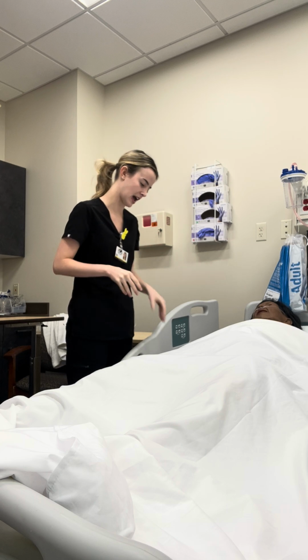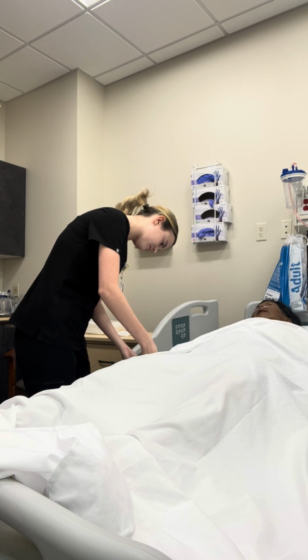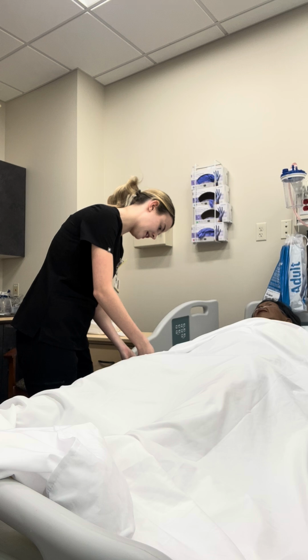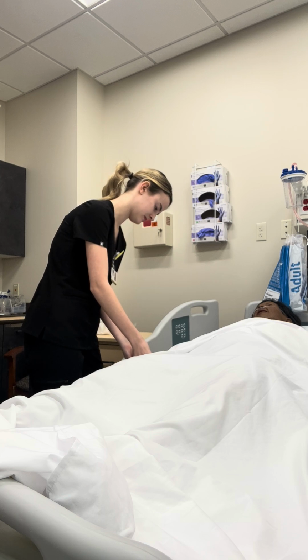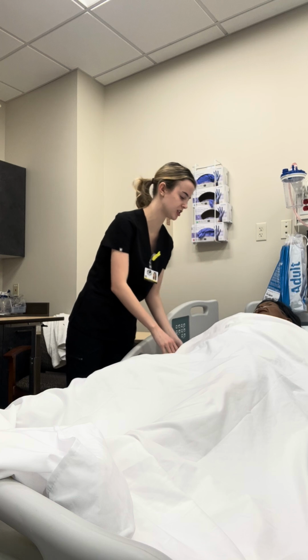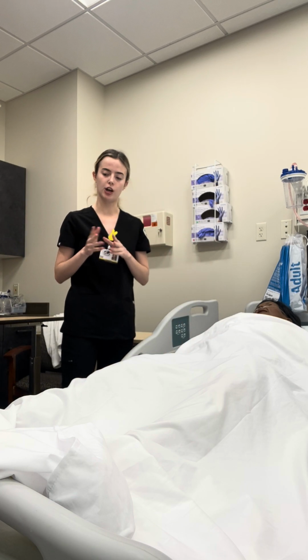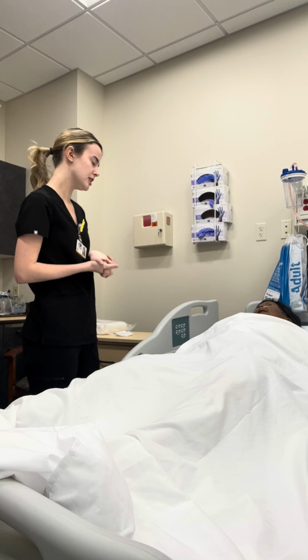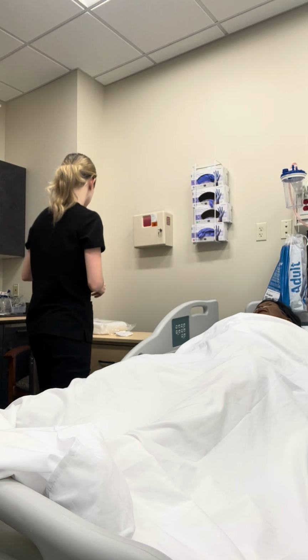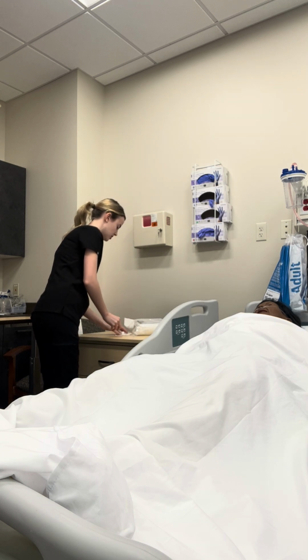I'm going to go ahead and have you verify your first and last name. Awesome. And your birthday. Okay. And do you have any allergies? Okay, so the patient has verified they don't have any allergies to anything that I'm using. So I'm good to go ahead and continue with the procedure. So I'm going to go ahead and gather my supplies. I have my Foley kit here and my stat lock.